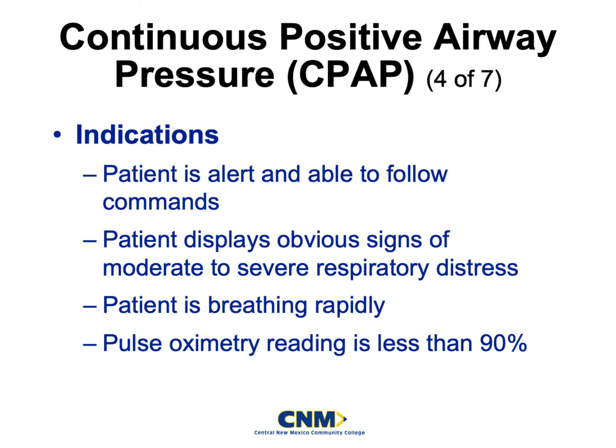And again, you can put the CPAP on in order to stabilize your patient. Once they become stabilized and you are comfortable with it, you are seeing good improvements, at that point you can think about maybe taking them off the CPAP and putting them on a non-rebreather to maintain the patient. But it's really going to be based all upon patient presentation, and you will definitely get more training on the CPAP when you get into your services.